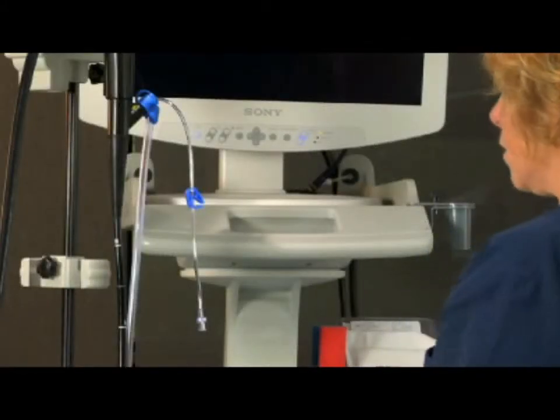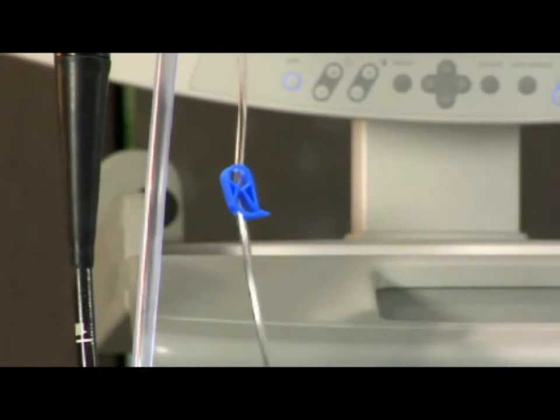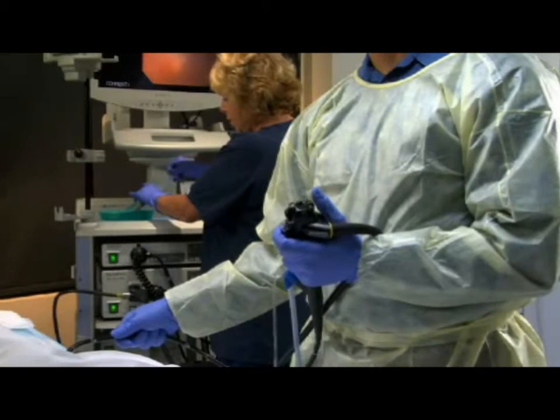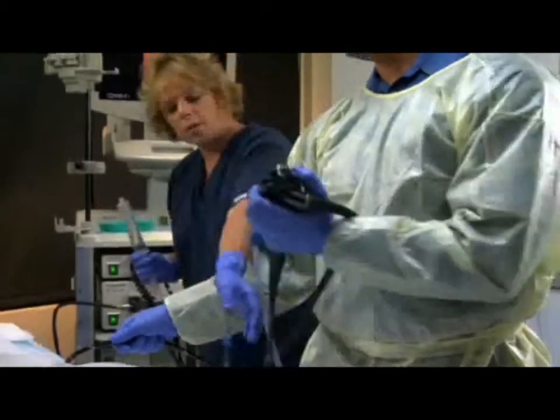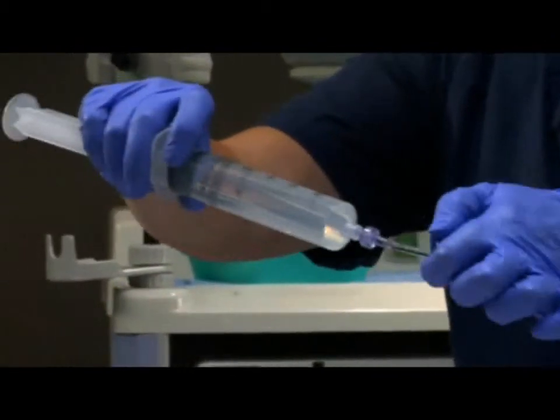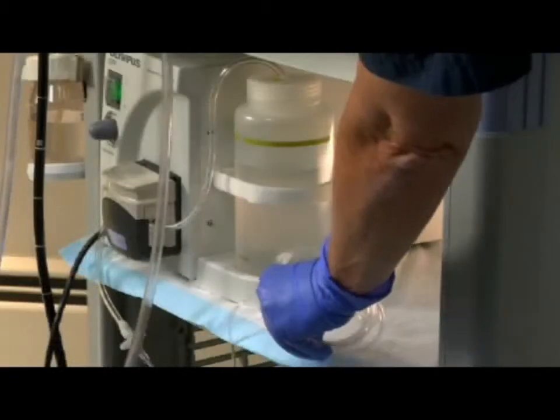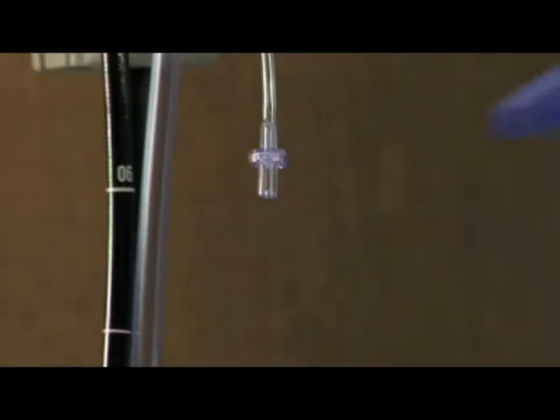If irrigation is not needed for the procedure, close the blue pinch clamp on the irrigation line. If irrigation is needed for the procedure, there are two options. Option 1: connect the irrigation line to a 60 cc syringe. Option 2: connect the irrigation line to a water pump.